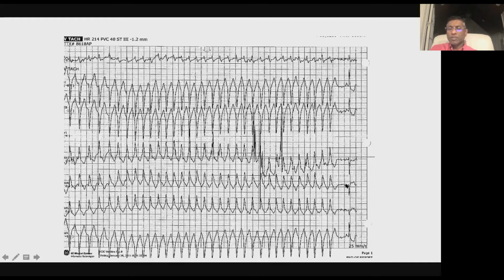Now look at that P wave and walk it over here. Could this be the P wave? No, sir, it won't be. It's tough to call that a P wave. That one looks positive, this one looks negative. So maybe not, tough to tell, okay? Here's my feeling, and we'll come back to that P wave in a second.